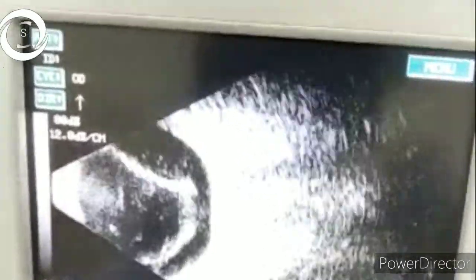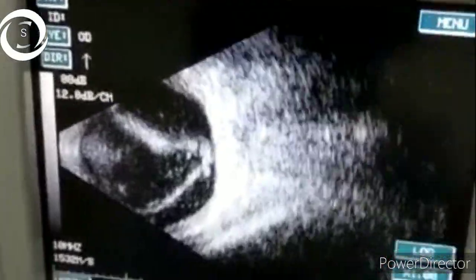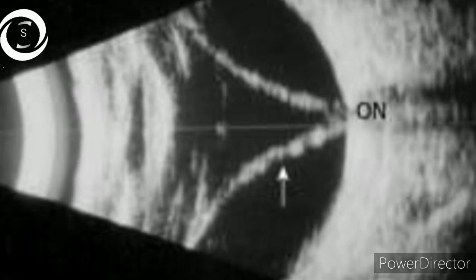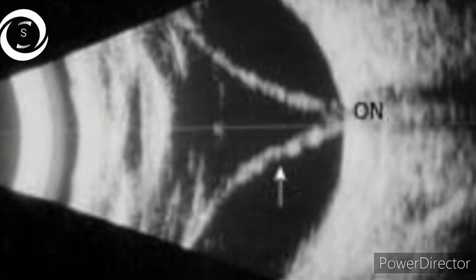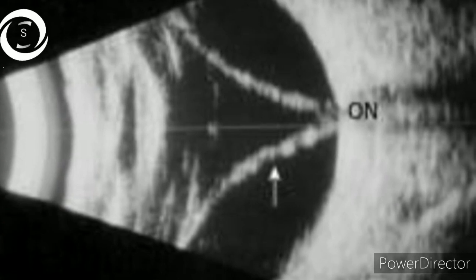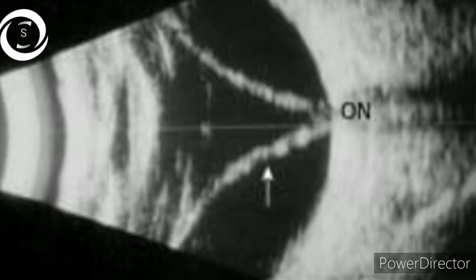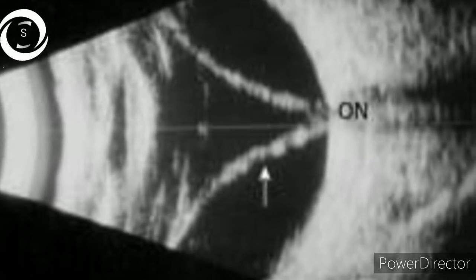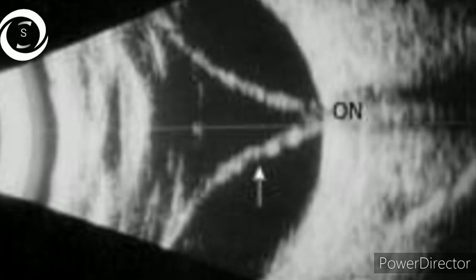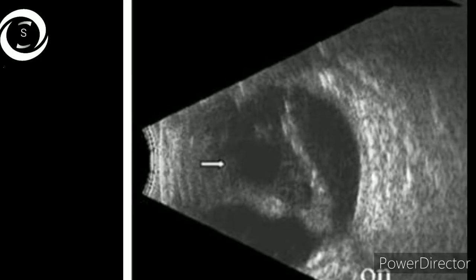On dynamic B scan you can see the uniform thickness of the hyperechoic membrane attached to the optic disc. The A-scan of retinal detachment is highly reflective compared to PVD, with no undulating after movements. The sixth static B scan shows open funnel RD attached at the optic disc, and the seventh B scan also shows retinal detachment with optic disc attachment.